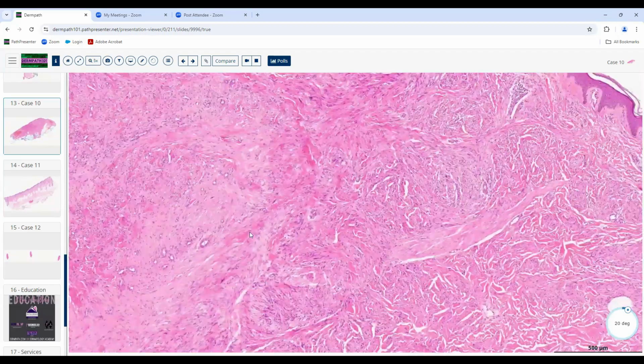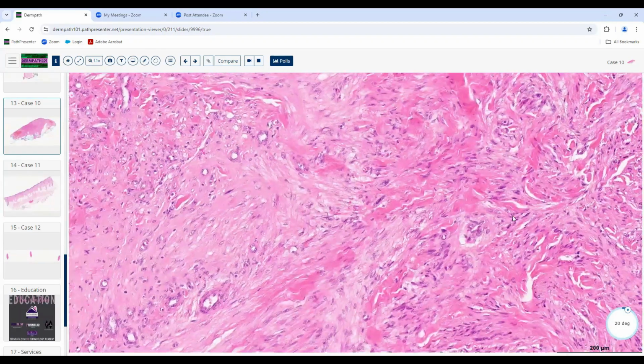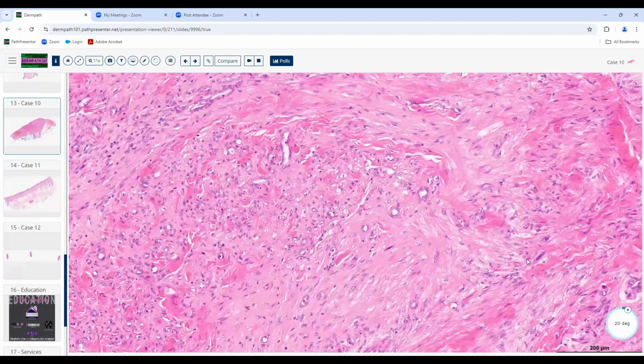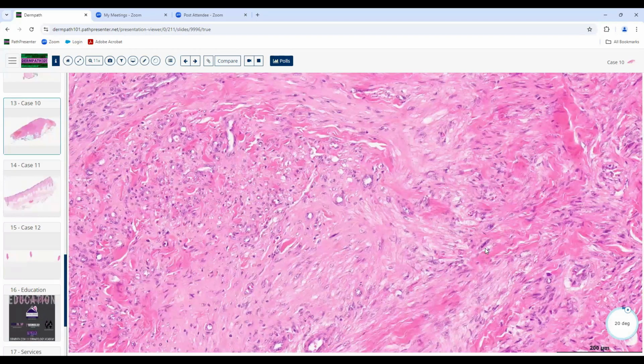We know that when we're looking at the three main types of differentiation, we look at the nuclei of the cells. If it's neural, it's usually a delicate spindle cell that looks kind of like a lazy S, swimming slowly in a soft way through the slightly fibromucinous stroma most of the time. That's what we look for when we see neural most of the time.